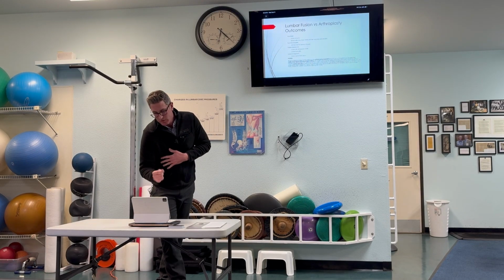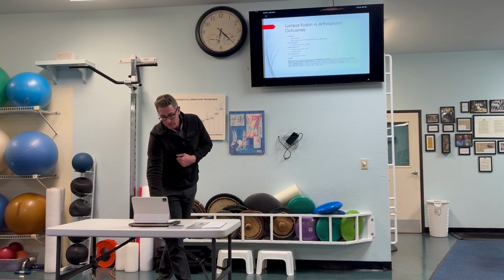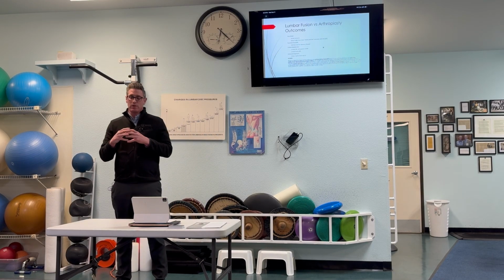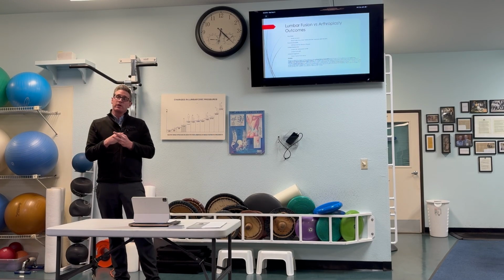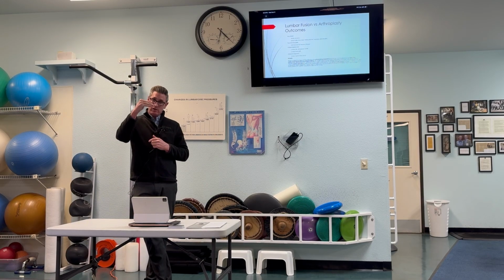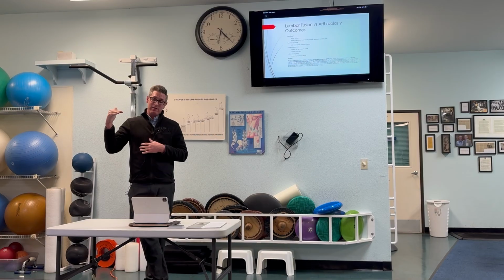This is a little bit more of that critical data. I think this was pretty interesting in that both of these did have some evaluation of the adjacent segment, as we talked about before. Some of these studies looked at the adjacent segment of a spinal fusion versus that of a lumbar disc arthroplasty. Those with a spinal fusion had about 35%, a little bit less than that, adjacent segment disease, radiographic breakdown of those adjacent segments, whereas a disc arthroplasty had about half of that.